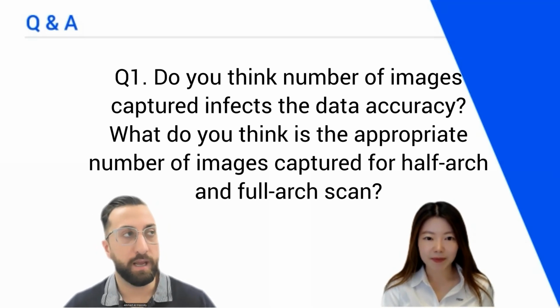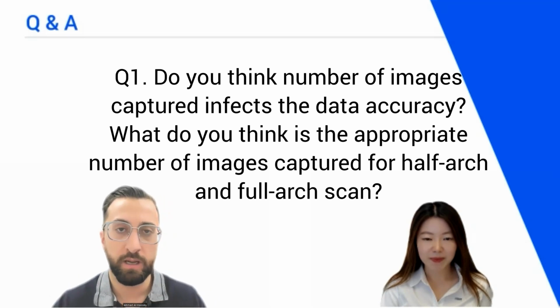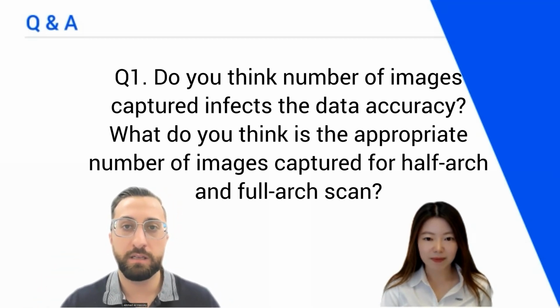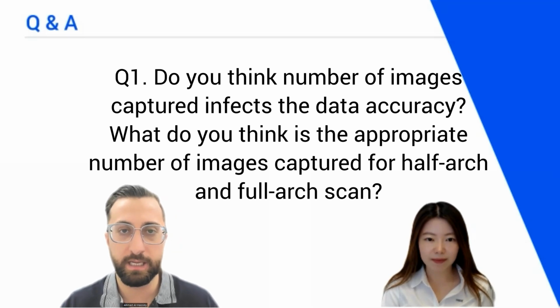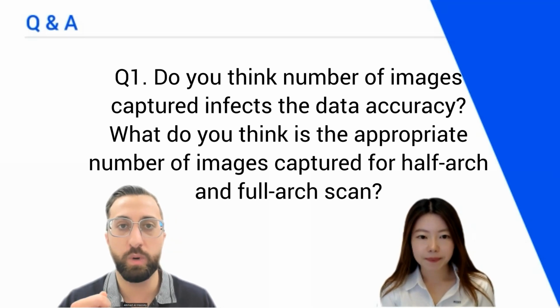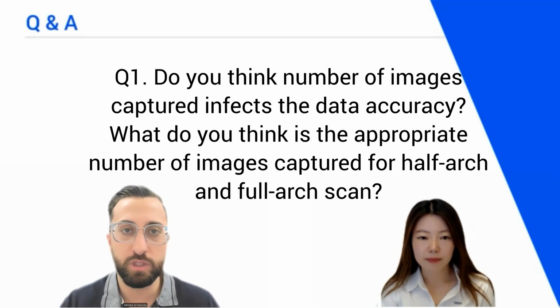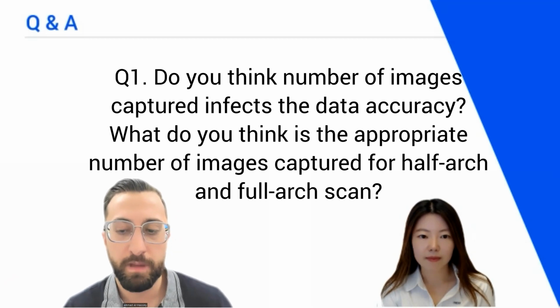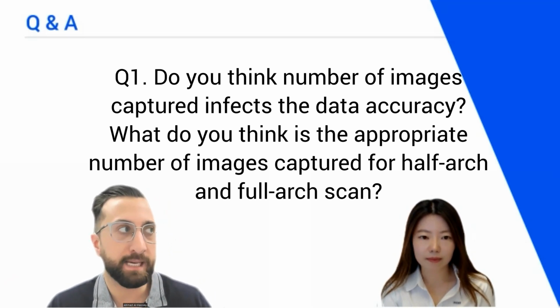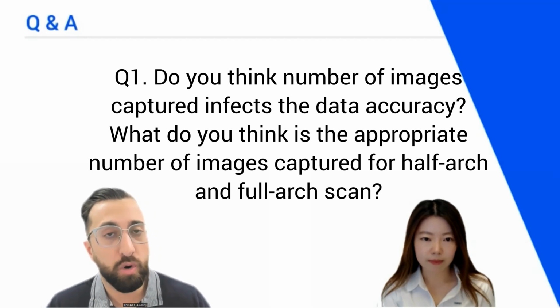That's a really good question. And I think yes and no. I mean, the thing to realize is that the more images you are capturing, the scanner is just joining those images together. It's like the first scan image you take, every subsequent scan image is connected to that. So if you sit there on the same tooth and you're constantly scanning it, it is just layering more and more images.